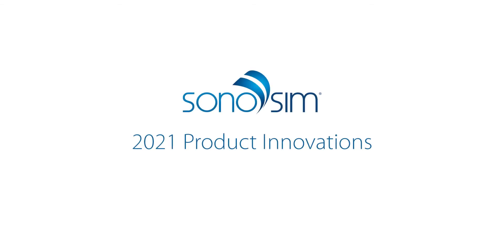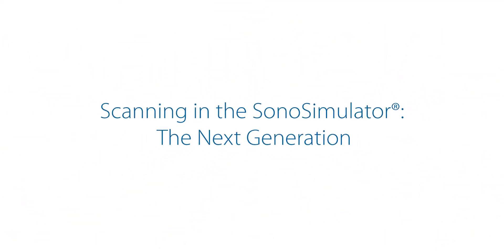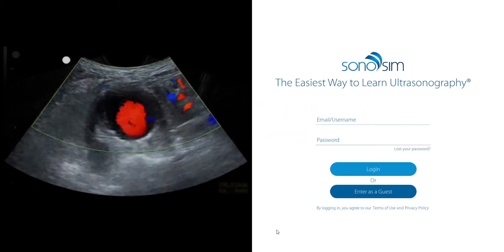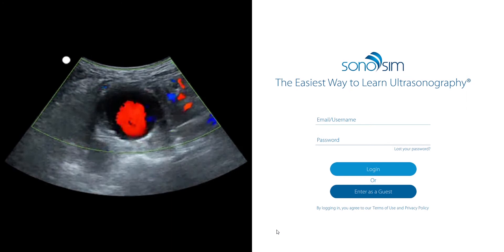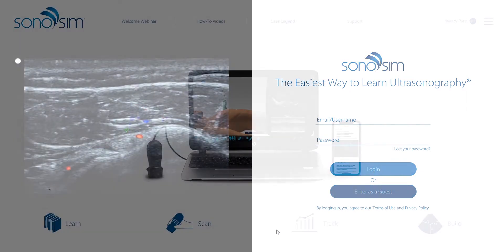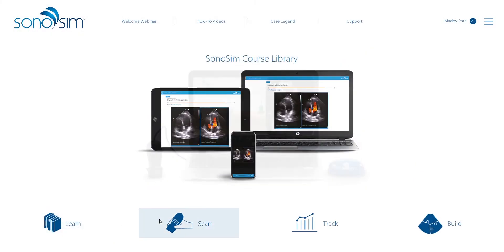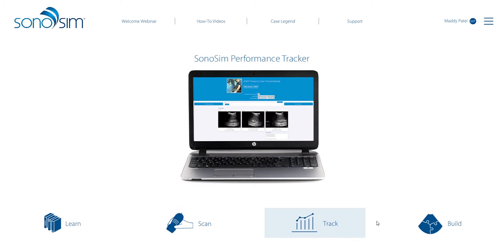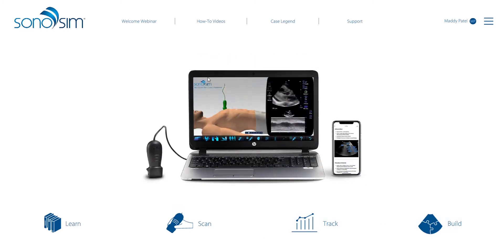See what's coming throughout 2021 to enhance your ultrasound training experience with Sonosim. You'll soon experience an enhanced Sonosimulator for scanning real patient cases. At login, you'll see the latest ultrasound training content. A new main menu gives you clear access to your entire suite of products as well as helpful reference material, such as how-to videos and a legend listing the hundreds of scanning cases and pathologies available.